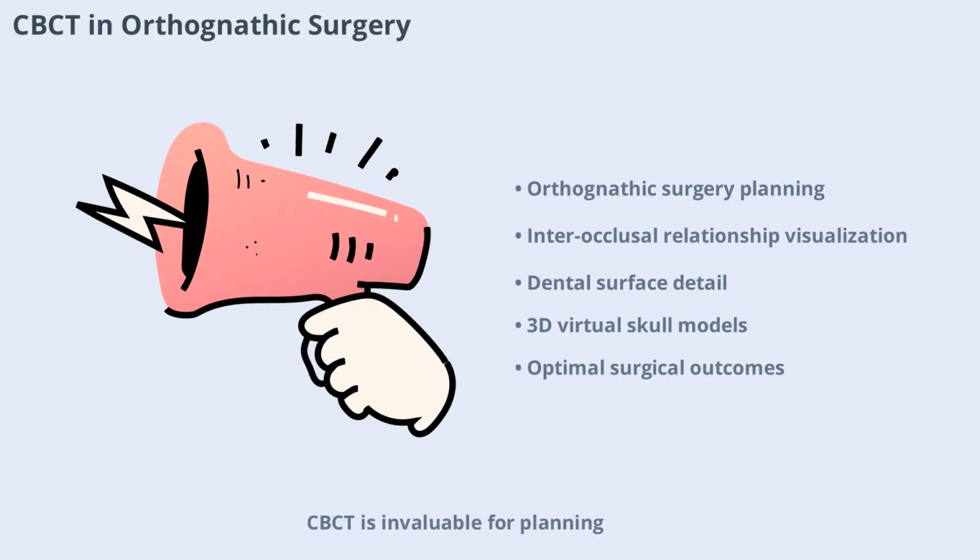CBCT is invaluable for planning orthognathic and facial orthomorphic surgeries. It provides detailed visualization of interocclusal relationships and dental surfaces, augmenting 3D virtual skull models. This information is vital for precise surgical planning and achieving optimal outcomes.